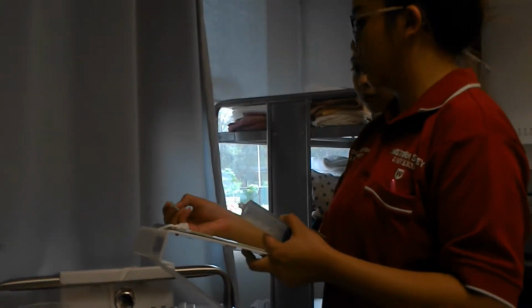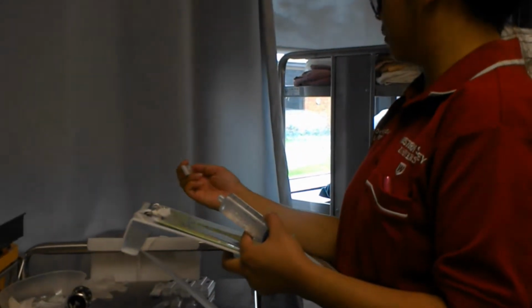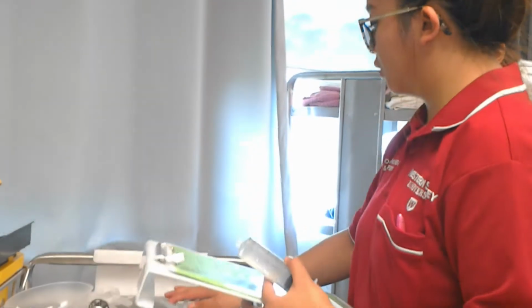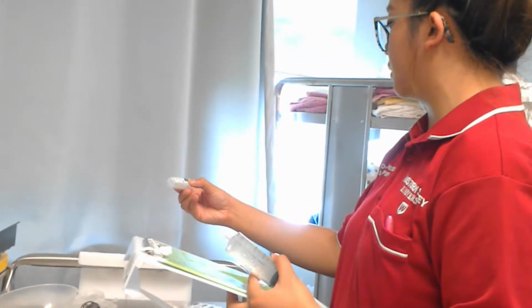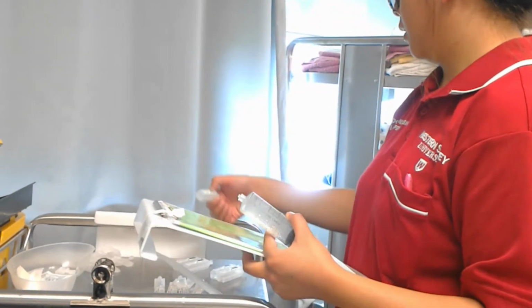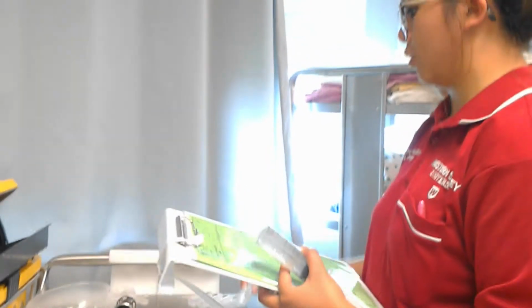Morphine sulfate 10 milligrams in 1 mil, expiration 10/2020. Morphine sulfate 10 milligrams in 1 mil, expiration 10/2020. Morphine sulfate 10 milligrams in 1 mil, expiration 10/2020. And the last one of morphine sulfate 10 milligrams in 1, expiration 10/20. And I drew up also 45 mils of normal saline to make up the 50 mils in total. And I've got sodium chloride here, which is September 2018. Each vial contains 10 mils as well, and all are expiration September 2018.